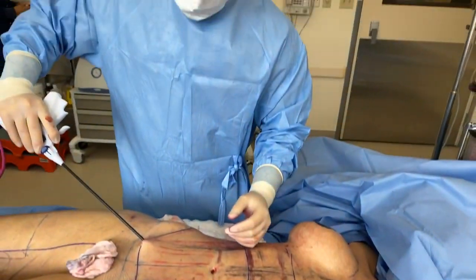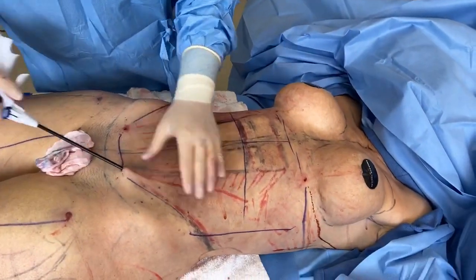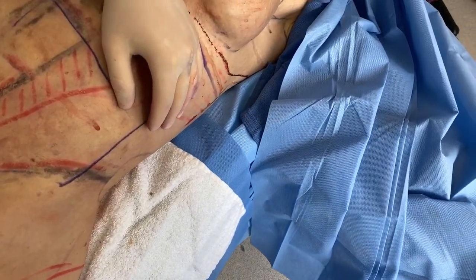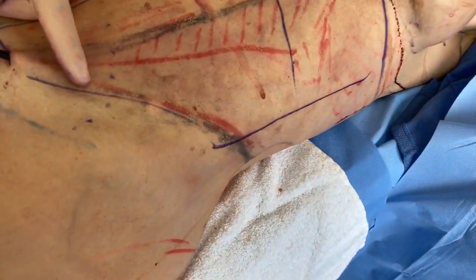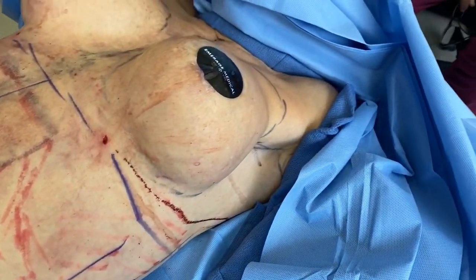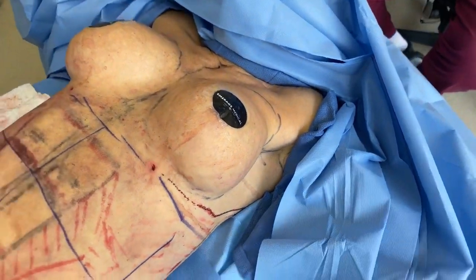Sometimes you need to have a tuck, and that's what we're doing here. So we're also going along the back and along this V-taper. Look at that hip bone — you can see we're really defining out the hip bone.